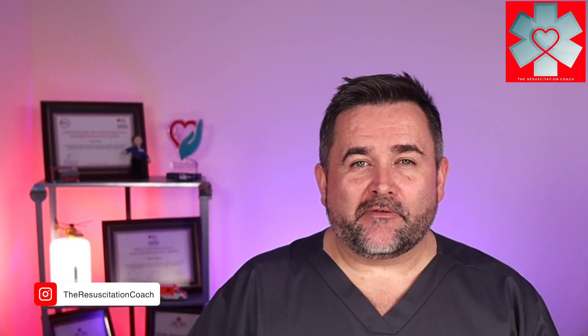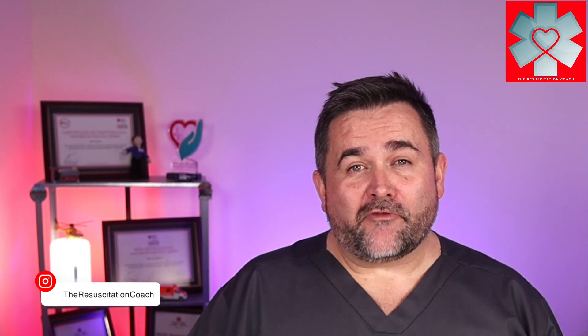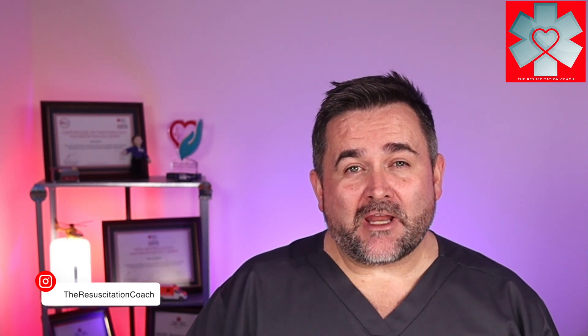In this video we'll be demonstrating how to perform an operational check, how to defibrillate, perform synchronized cardioversion, and do transcutaneous pacing or TCP using a Philips Hard Start Intrepid defibrillator.